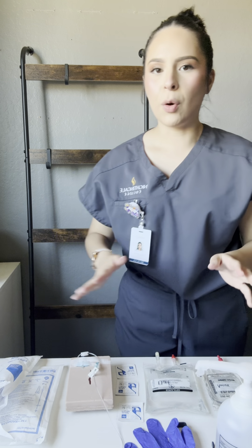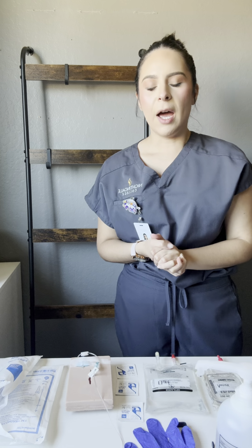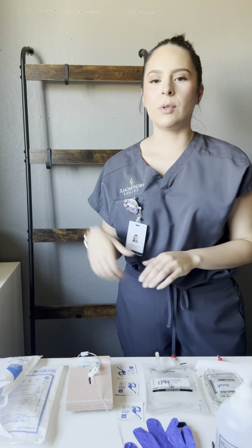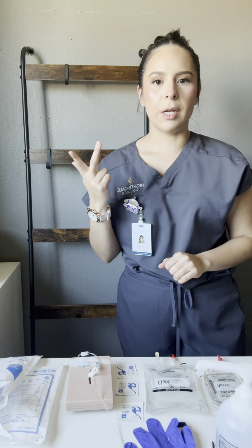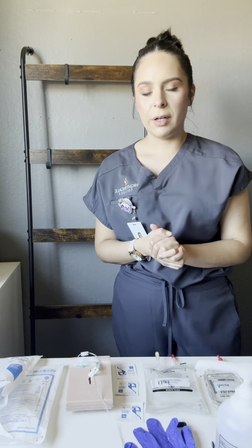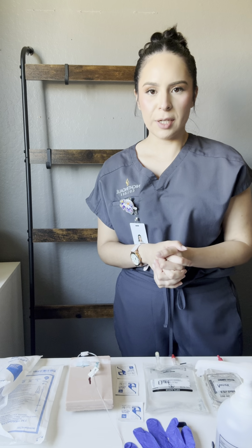The first thing that I'm going to do is verify my healthcare provider's orders in the MAR. I'm going to verify my patient using 2 patient identifiers, and then I'm going to go over the 6 rights of medication administration, which is the right patient, right drug, right dose, right time, right route, and right documentation. Then I'll verify my patient's allergies in their medical record, and also verbally with my patient.